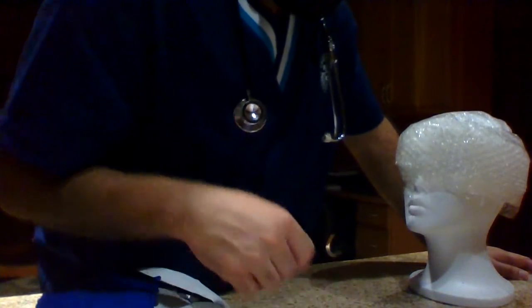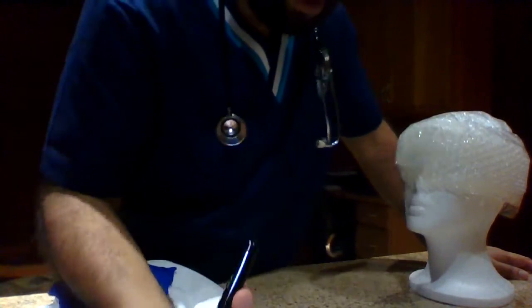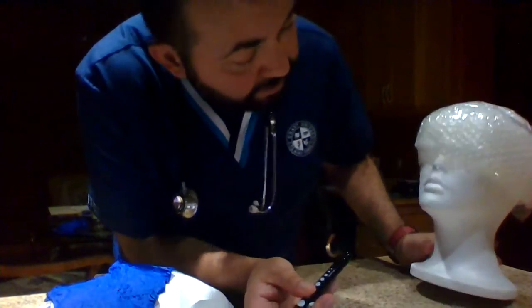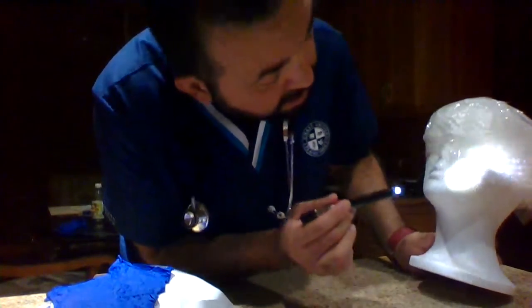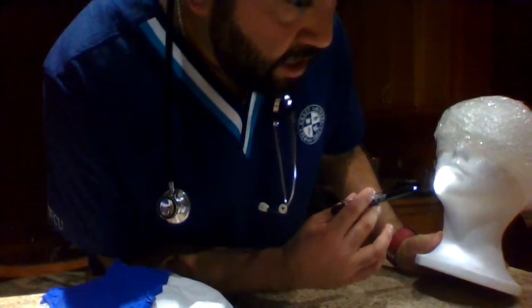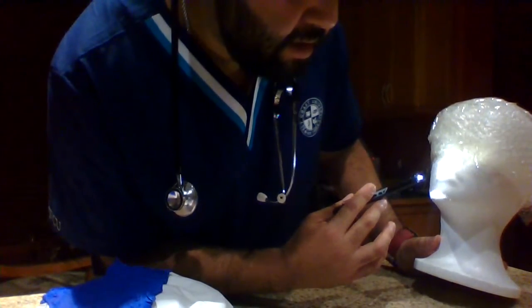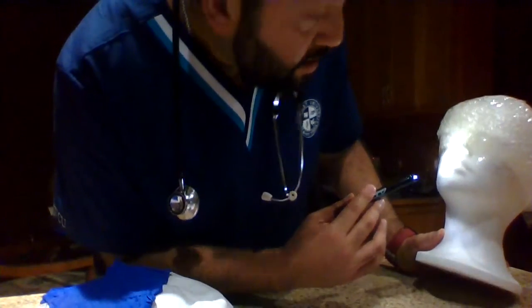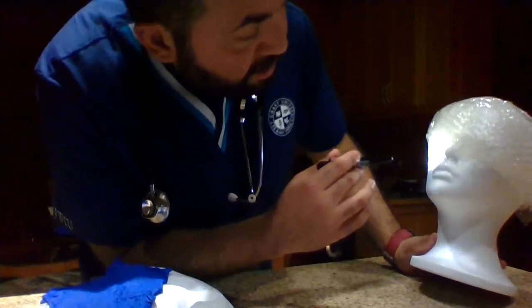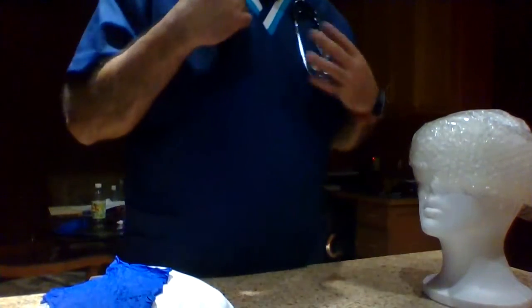So now we're going to do a facial assessment. You grab your pen light, and you're going to view up your client's nostrils. You just have to see. All right, everything's good. Nothing's in the way that's going to interfere with the procedure.